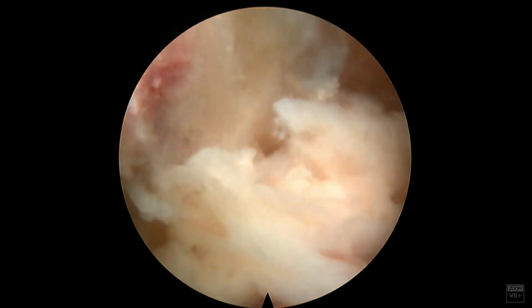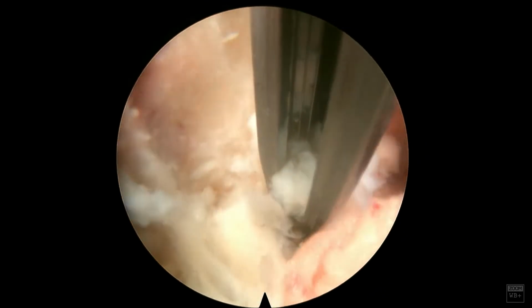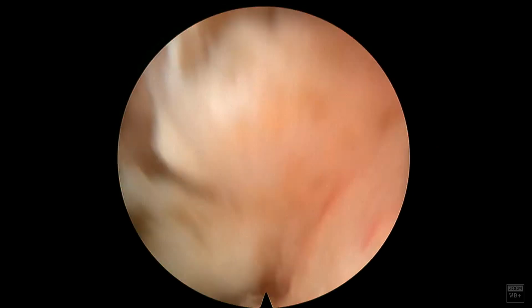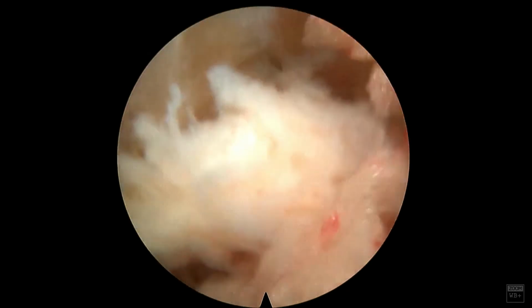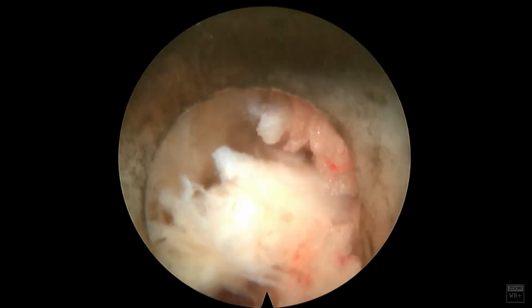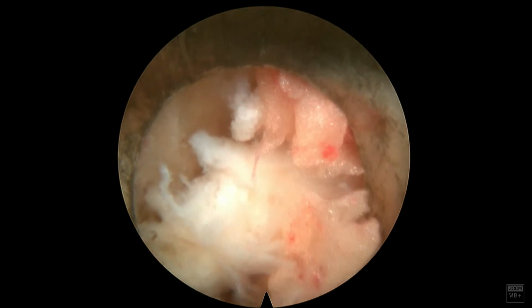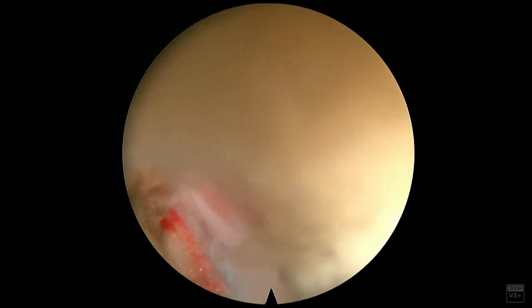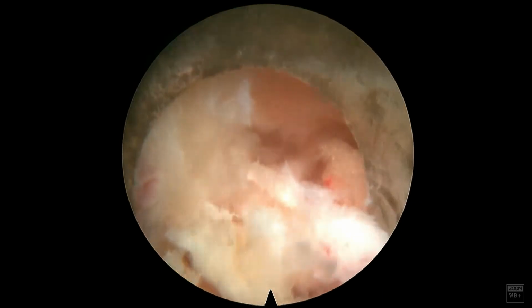These Kerrisons, unfortunately, are not super robust, so you want to do most of your bony work with the burr if you can. The Kerrisons are not the normal size Kerrisons unless you're using the older traditional Joymax probe, or excuse me, a working tube. So again, here's my pituitary. I'm removing a lot of this. This ligamentum was really sticky, so it was really hard to remove a lot of this.